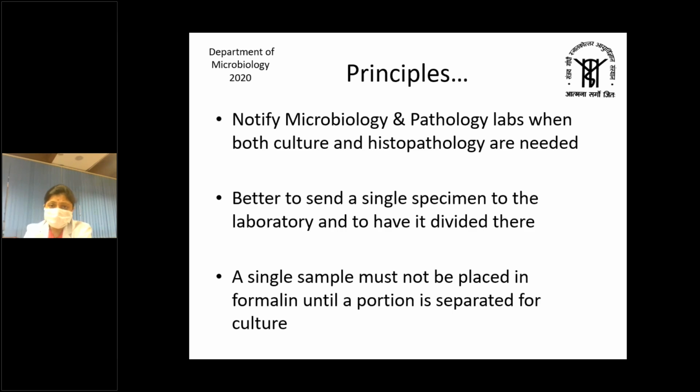Now there is one very important point which I would like to mention. We should always notify the microbiology and pathology labs when both culture and histopathology are needed. This is especially important for biopsy samples, and many times these samples are precious because they have been obtained after interventional radiology. The basic difference is that the sample will be put in formalin if it has to be sent to the histopathology lab, while the sample has to be put in normal saline if it has to be sent for culture.